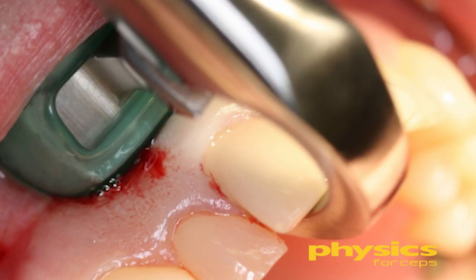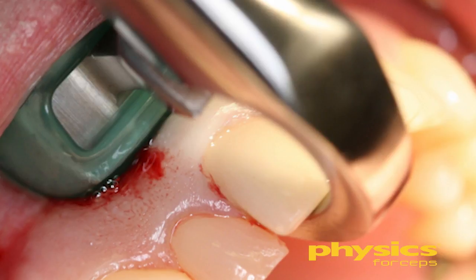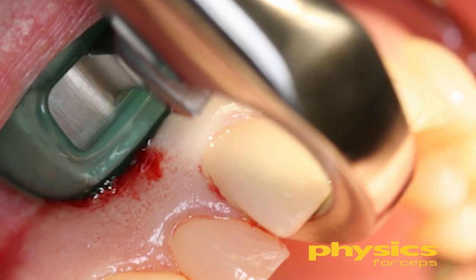I'm a right-handed dentist and I don't have a lot of strength in my left hand, but I'm using my left hand to demonstrate how I'm not squeezing — not putting a lot of pressure — and I'm simply rotating my wrist towards the tip of the nose. Not squeezing the instrument; it's not a conventional forcep.